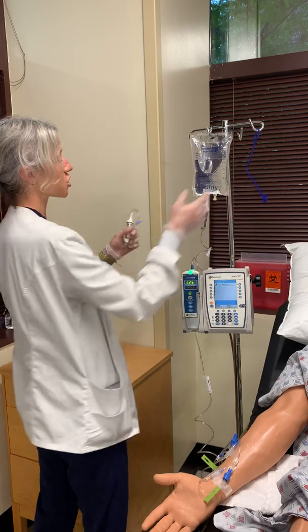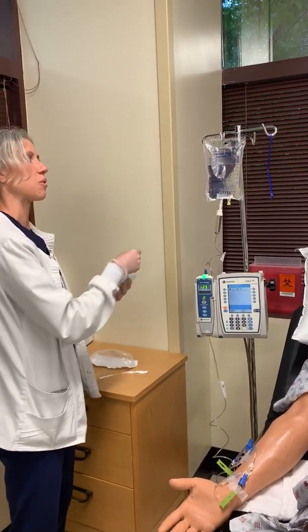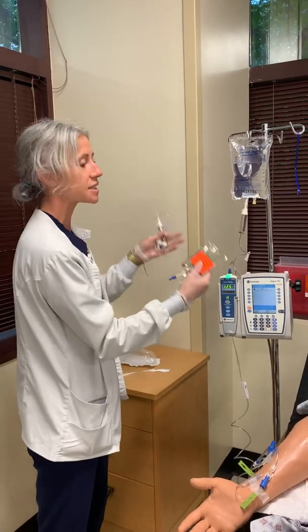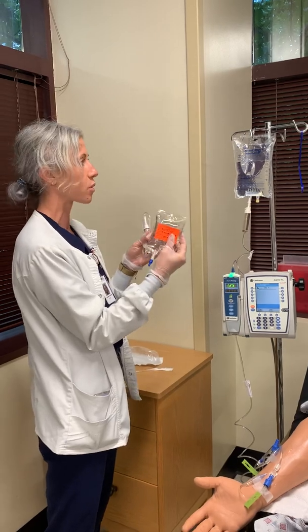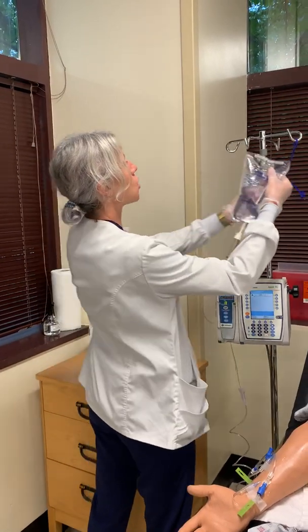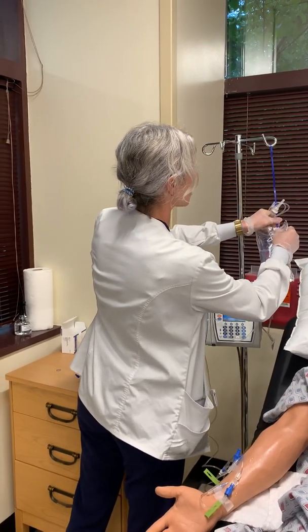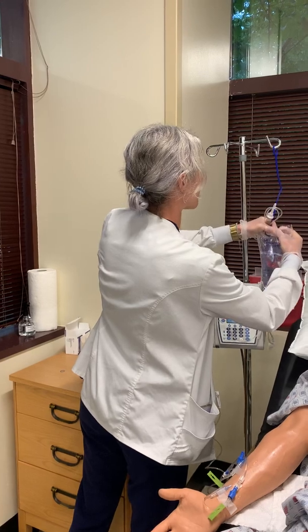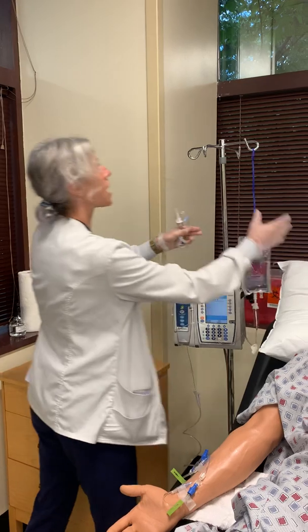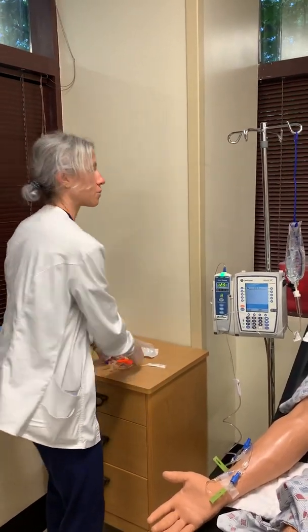So we're going to do a huge transition because we are moving. We want him to get this antibiotic now, right? We do not want him to get this, okay? As when we hang this and set the pump up, this is what we want him to get. So I'm going to transition my primary bag over here, and it's going to now sit at a lower level, okay? This is a gravity issue, because this pump wants to give whatever is hanging higher. So in this case, I want it to give my antibiotic, okay?